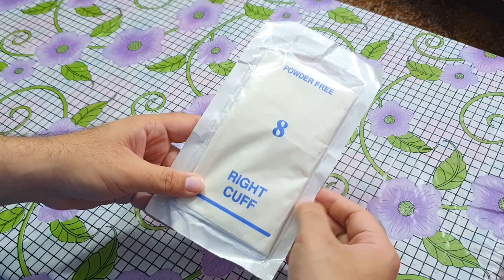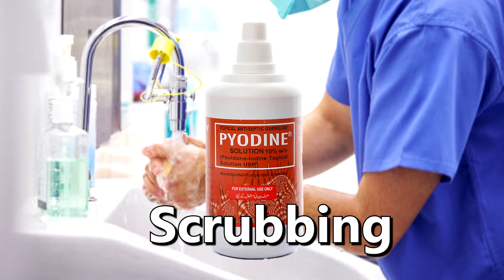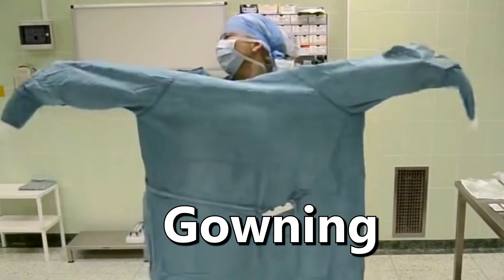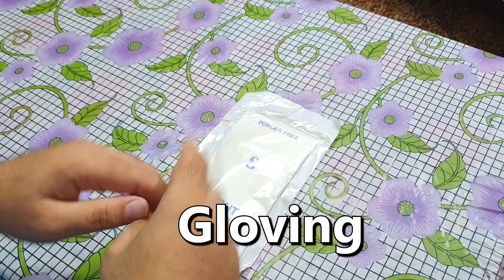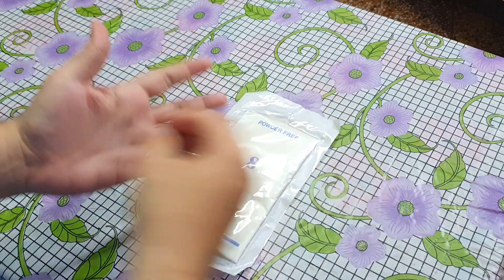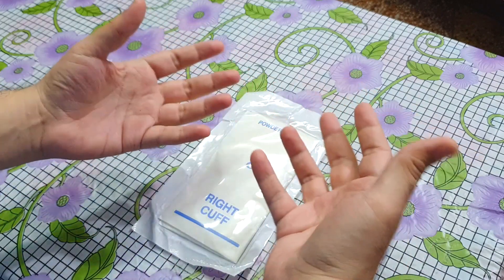Suppose you are going to wash up for a surgery. First you will do scrubbing, in which you will wash your hands with an antiseptic solution like pyodine. After scrubbing you will do gowning, in which you will wear the sterilized gown without touching its outer side to maintain its sterilization. Note that scrubbing decreases the number of microorganisms on your hands but your hands will still not be completely sterilized. Therefore you will wear these sterilized surgical gloves with a specific technique so that sterilization is maintained.